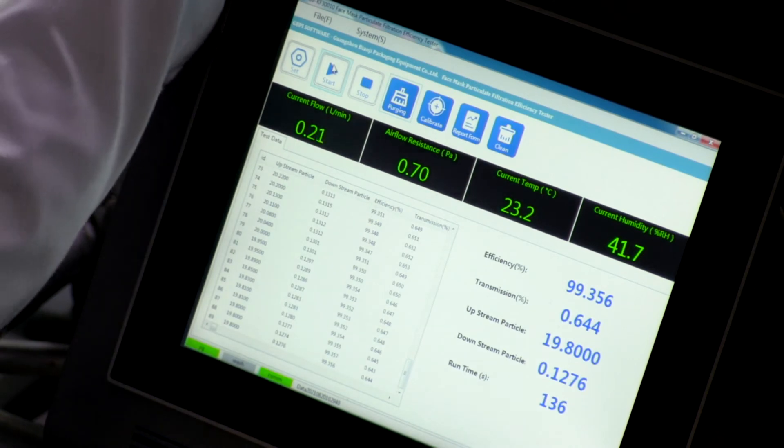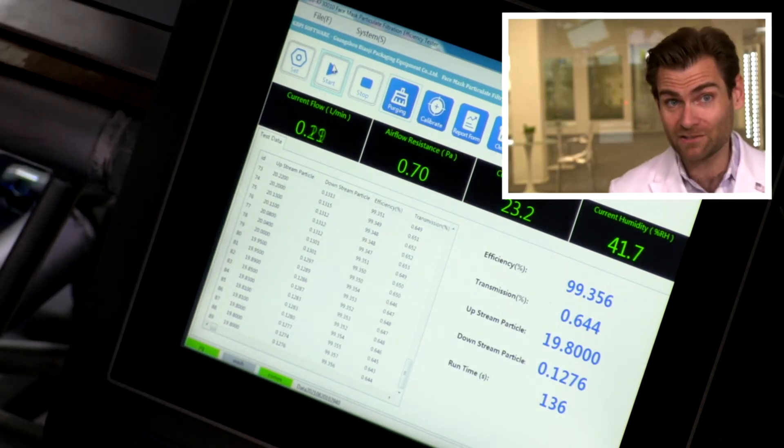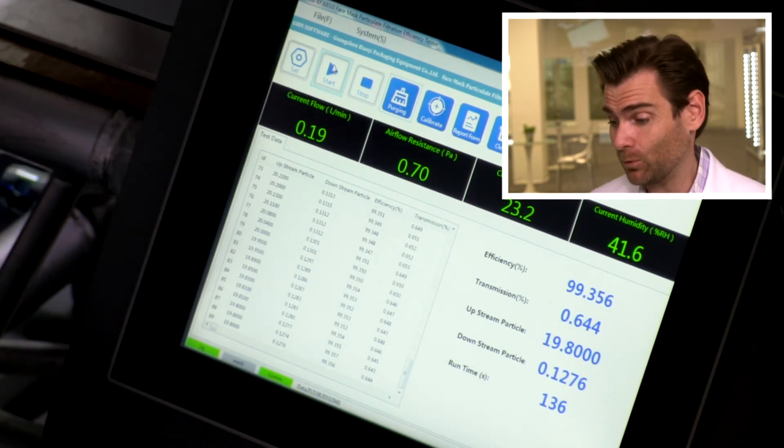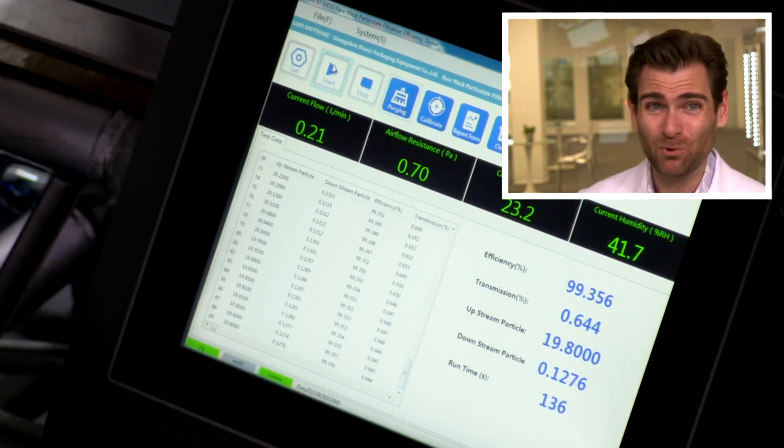When you look at the results — surprisingly, even though there's no manufacturer name or anything, they made a good mask. Efficiency: 99.356%. So Peter, you got lucky on that one. It's weird that they're not following the full GB 2626 standard, but they made a good mask. You were pretty well protected.